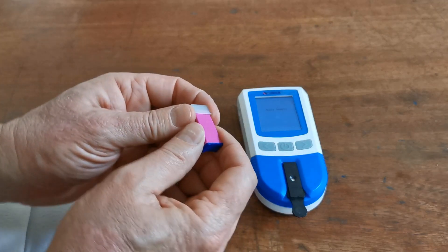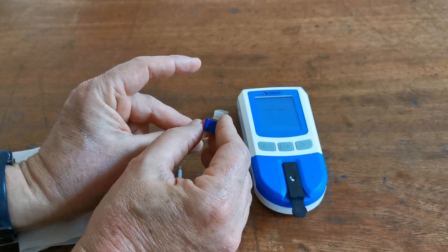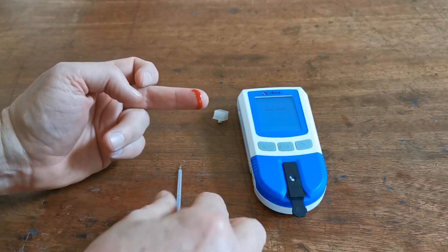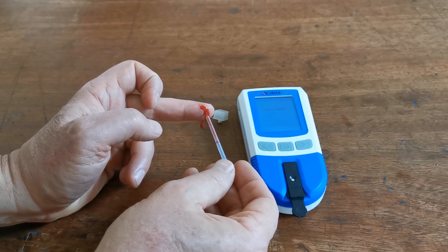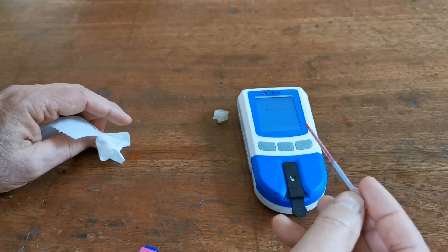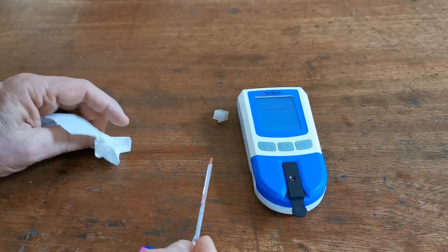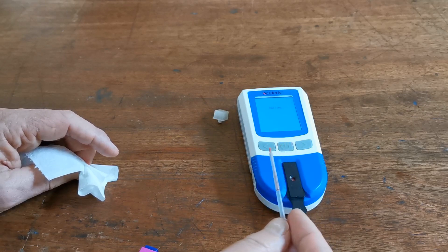When you are ready to sample, remove the cover from the safety lancet. Brace the side of the finger you're about to lance and push firmly with the safety lancet against the finger — do not be timid, it's important you get a good blood sample. Wipe the first droplet away and allow the second droplet to form naturally. Then use the capillary tube — simply place it in the blood sample without squeezing the bulb — until it fills to the black line. When it has done so, squeeze the pipette to discharge the blood sample into the sample well on the test device. If you have formed any air pockets in the capillary tube, do not use that sample as it will be insufficient.